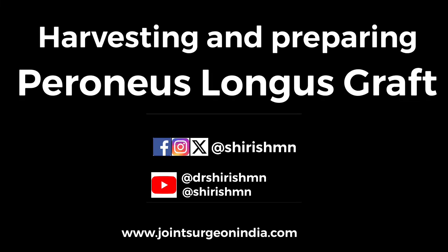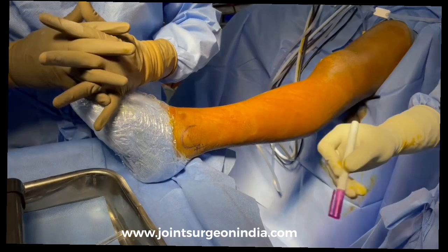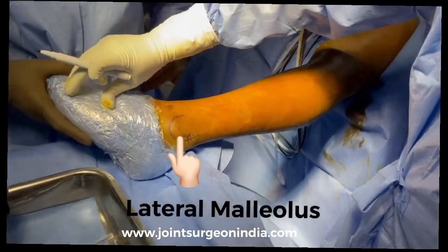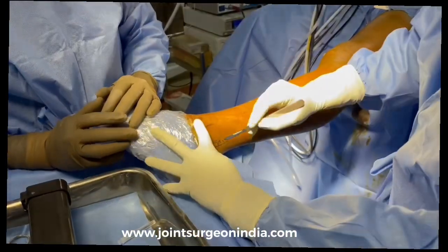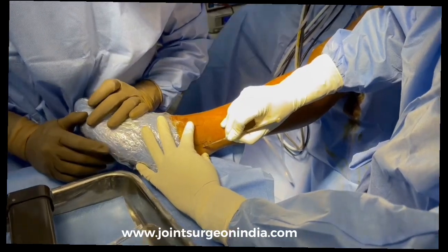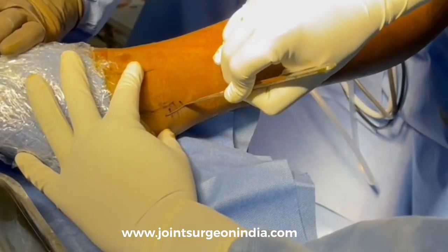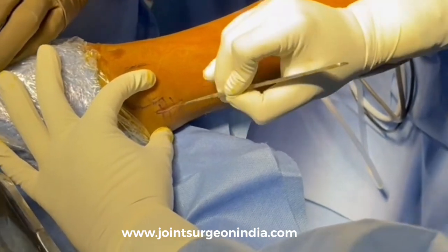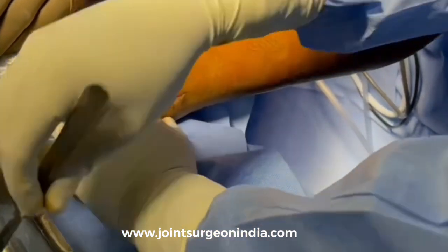This is a video demo of harvesting and preparation of Peroneus longus graft. The lateral malleolus is marked with a skin marking pen. The incision is just posterior to the lateral malleolus — a longitudinal incision about one to one and a half centimeters long, just posterior to the lateral malleolus, deepened in layers.